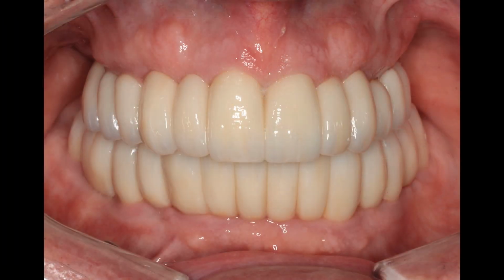Here's his final restoration, and like I said on his initial picture, it's remarkable that we didn't have to use any pink porcelain or pink zirconia on his final restorations because of how much bone he had missing.